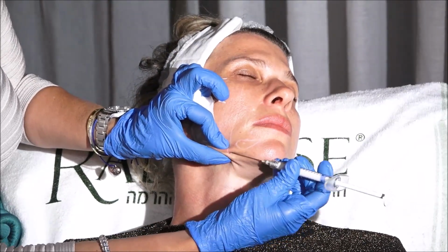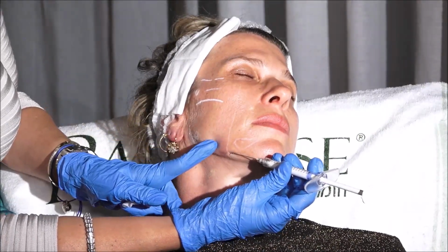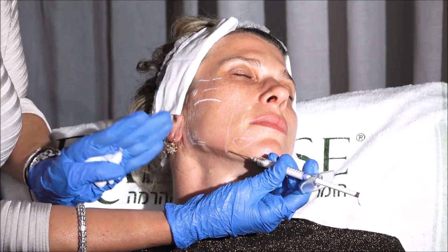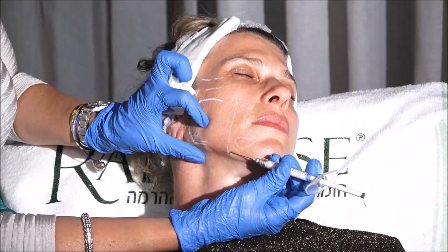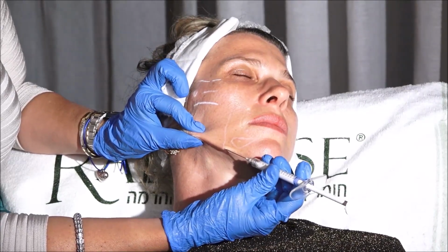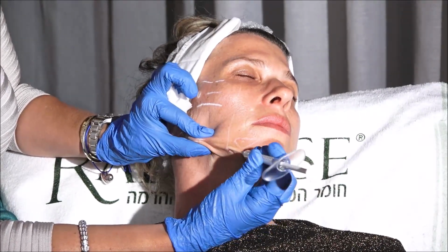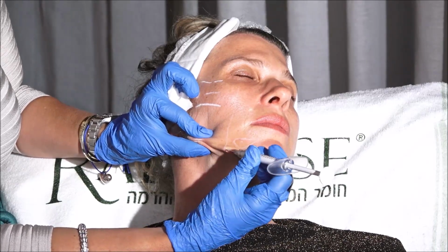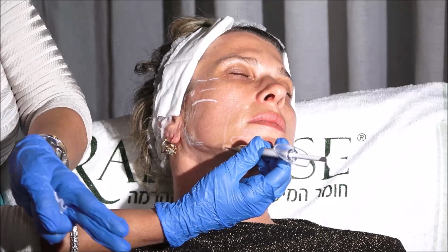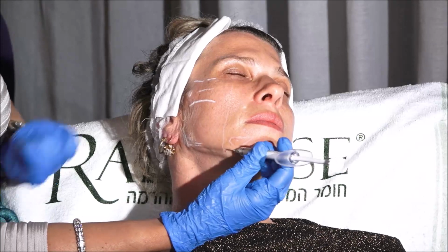I continue superficial. When I trespass the anterior border, I've already passed the danger, which is the facial artery that is deep there. What do I do? I tend. The fascia doesn't come with it, just the subcutaneous. So I try to glide my cannula as long as it's smooth. It cannot be otherwise, or you're rupturing and entering the parotid or inside the fascia. I don't want that. So this is smooth.